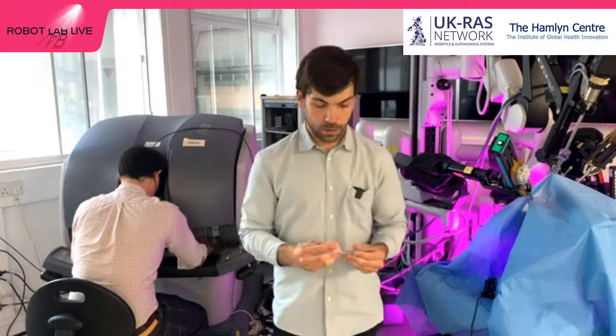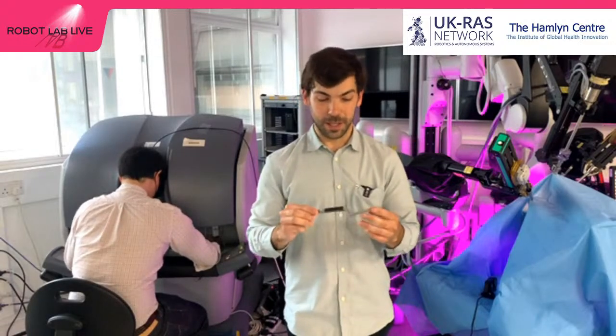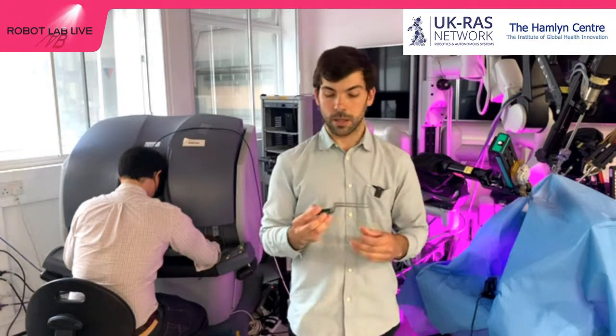And as you can see right now, this is a tool that is used in neurosurgery. It's quite a cool one. It's very lightweight. I'm a mechanical engineer, so I think I can appreciate the details of it, but it's lightweight, the profile is really amazing, and something very difficult to produce. But it's not enough for a lot of surgical procedures. And this is a point where medical robotics could help.